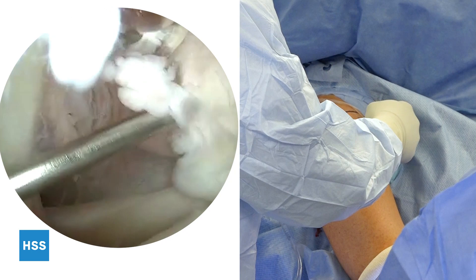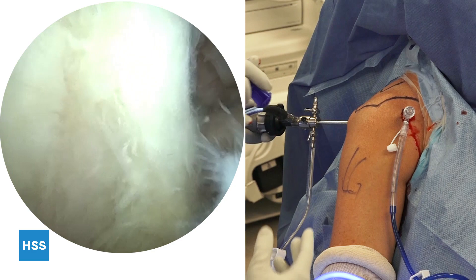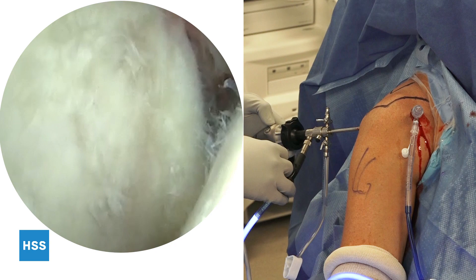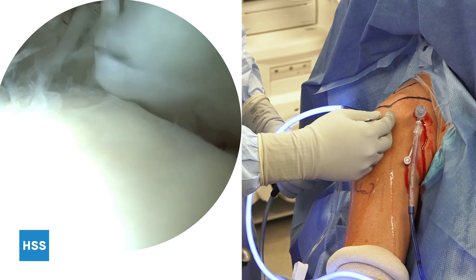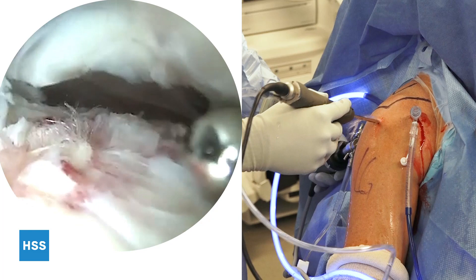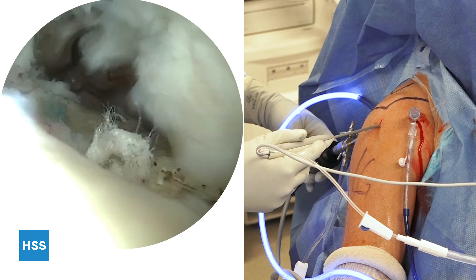We place a cannula to establish that portal to aid in instrumentation of the joint. The long head of the biceps tendon has some tenosynovitis but is otherwise intact, and therefore we will not perform a concomitant biceps tenodesis. The patient does have some chondral wear of both the glenoid and the humeral head. I establish an anterolateral portal using spinal needle localization directly over the rotator cuff tear site. Any remaining wisps of fibers are released with sharp dissection. A 4.0 shaver is inserted and debridement of the footprint takes place. An electrocautery device is then used to remove fibrocartilage at the rotator cuff insertion site to get down to native bone, after which the greater tuberosity is decorticated.